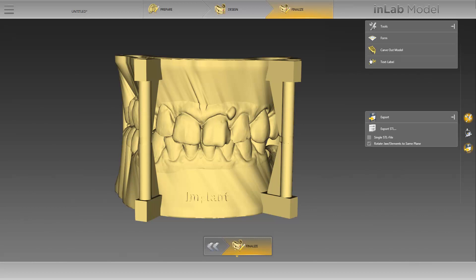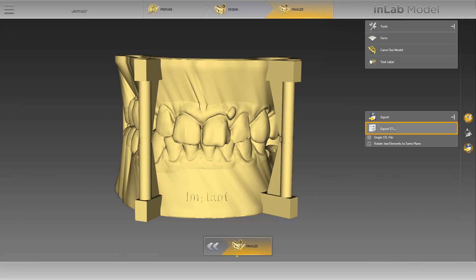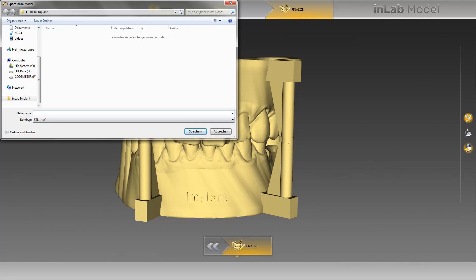Now we can export our model data. We have already opened the Export option of the page palette and deactivated the function Single STL File, as we wish to create a separate STL file for each element. The export is initiated by clicking on Export STL. A new window opens where you will automatically see your disk drives. In our case, we have already created a folder called InLabImplant on the desktop, and choose this as the destination to save our files. We name our file Patient1 and then click on Save.